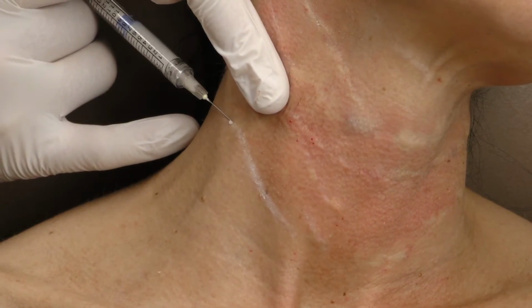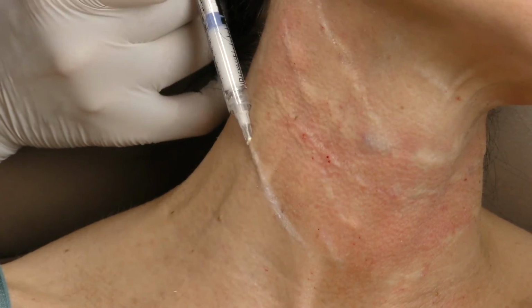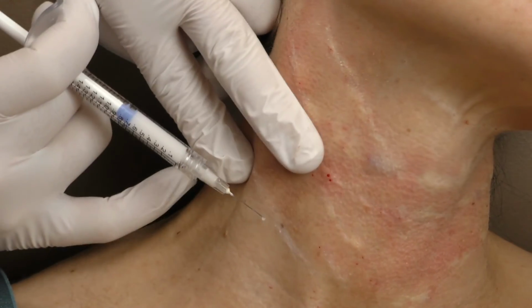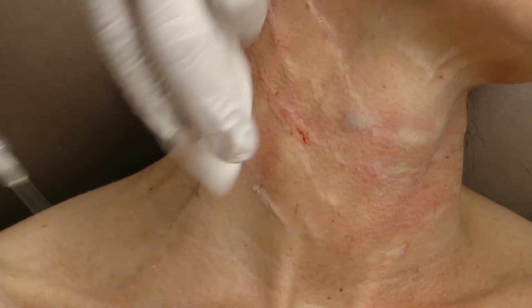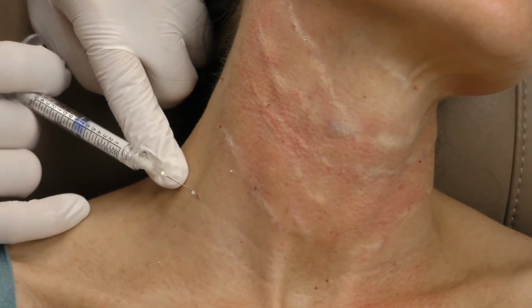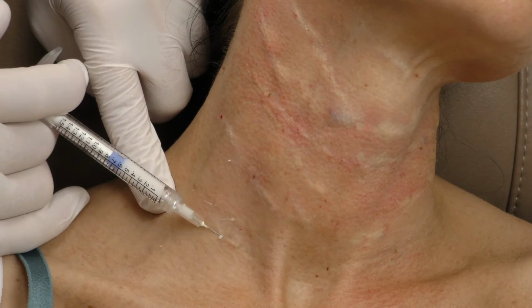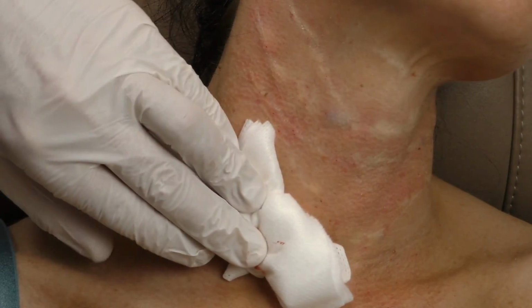And over here, the last line. There we go. Deep dermis or dermal-subdermal junction. Probably it is just below the dermis, because it's so thin here that I'm not even sure if the needle would actually fit inside the dermis. So I'm about 1 to 1.5 millimeters deep here. Very superficial, as you can see. And that's exactly where we want the product to work. That's where we need the neocollagenesis and the effect. All right, so we're actually almost at the décolletage level, and that is where I will be continuing.